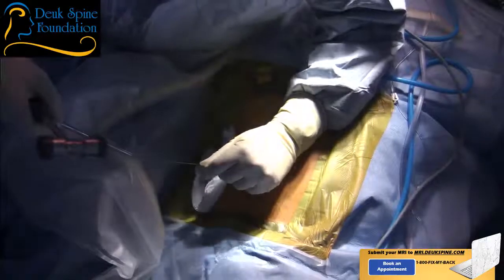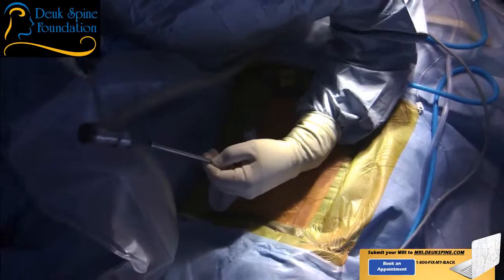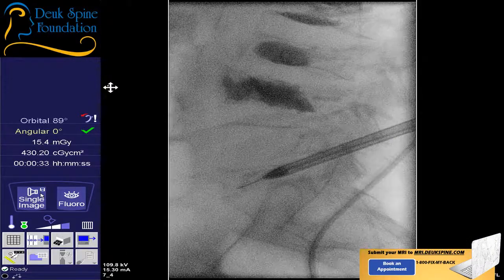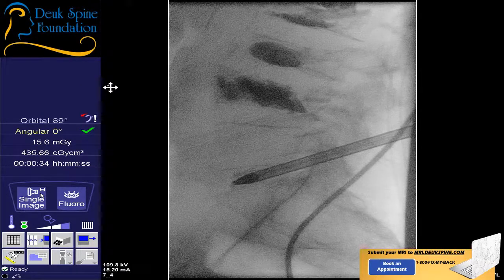Yeah, I know. Yeah, hang in there. We're almost done. This is that bad disc of yours. Yep. Bear with me. I need the mallet. Almost done. All right. Okay, you know what? I may be able to put a little in the disc, but it's going to leak out around the root. That's the only problem. So, okay.